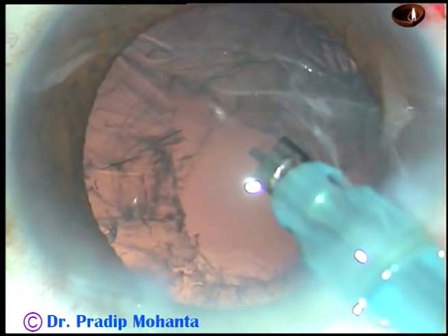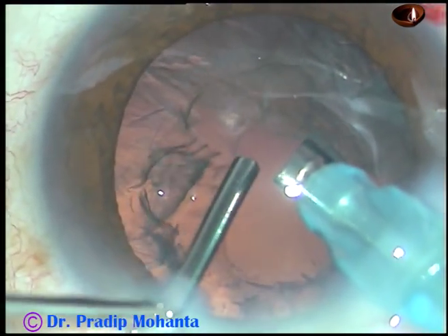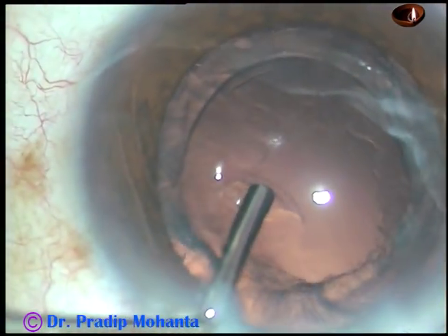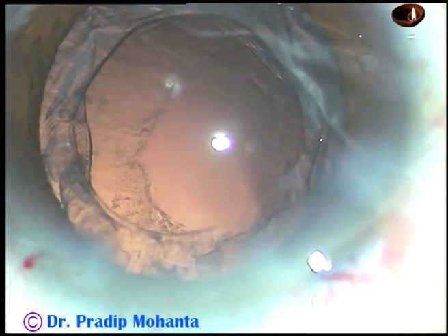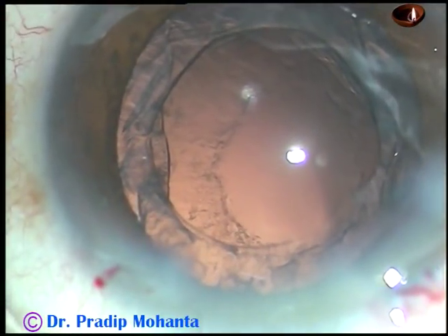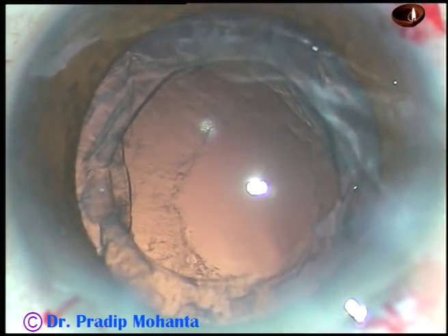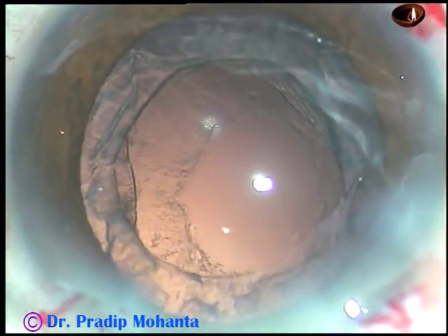Now, before coming out, I am injecting viscoelastic substance, though it was not necessary in this case. So if a posterior capsular rent occurs, always form the anterior chamber before coming out and inject visco.